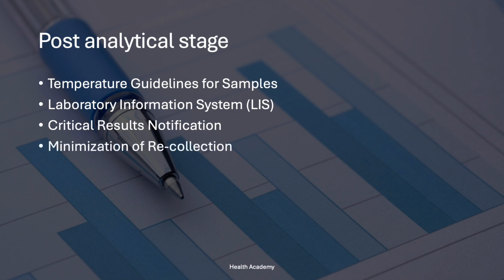Minimization of recollection. Avoid the unnecessary recollection of samples by ensuring precise and accurate testing procedures. Guidance seeking. Encourage staff to consult with seniors or management when in doubt, fostering a culture of communication and support.